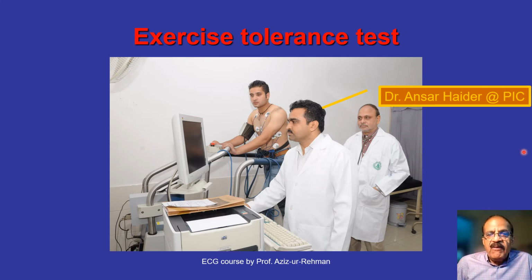Then the third possibility, which is fairly common, is that the patient is unable to achieve the maximum heart rate and also did not develop ECG changes and no chest pain. This test will then be reported as inconclusive. Then this patient would require some other tests. There are patients who cannot do exercise. They can be offered a pharmacological stress test. That means an injection of dobutamine is given as an intravenous infusion. Heart rate is increased, and you then expect the ECG changes, just like we expect during exercise.